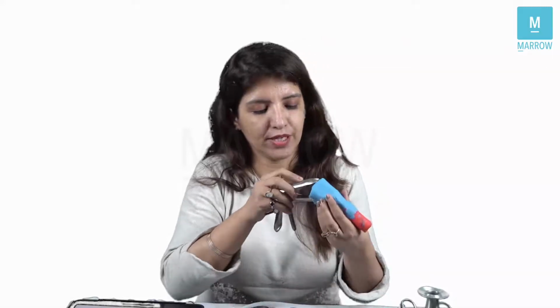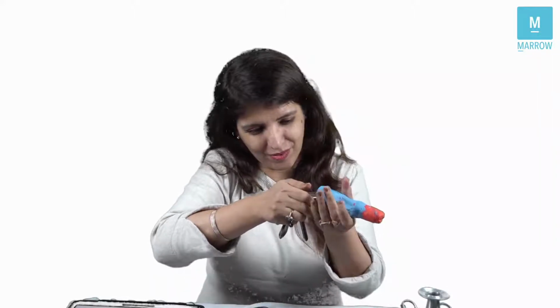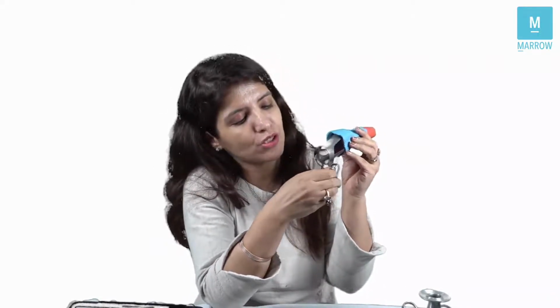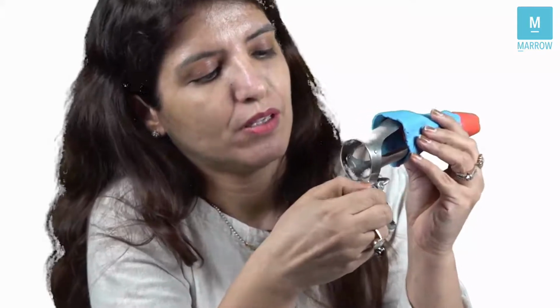Now Cusco's speculum has double blades. So my Cusco's is a little old now, right? Now I am going to insert the Cusco's speculum and then tighten the screw over here, right? When I tighten the screw over here, the Cusco's is going to tighten and it is a self-retaining speculum. So my hands are now free for whatever procedure I need to do, right?